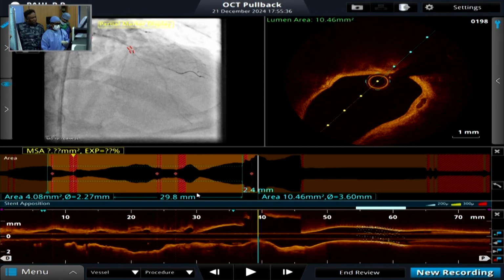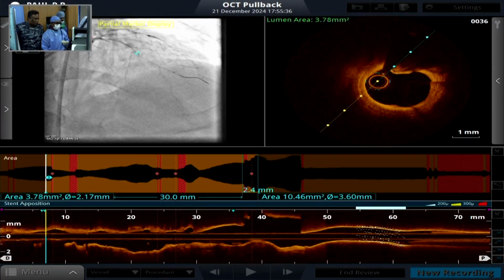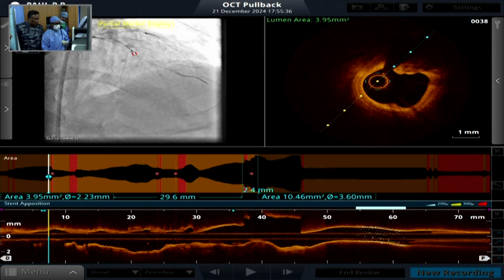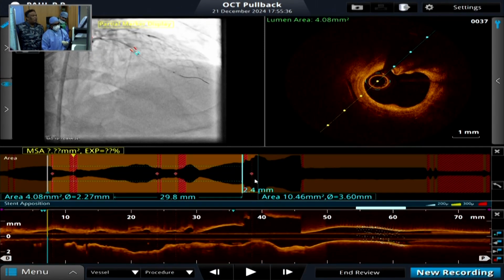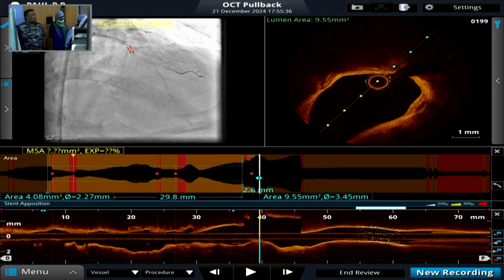29. Okay, 30. Or even Vishnu, should we offer 20? The advantage of 33 would be 1 millimeter into the left main and 1 millimeter distal. 33 would be preferable. If you haven't opened a 3, 2.75 also will be okay, because distally it's a tapering vessel. 2.75, then we'll post it with 3.5. That's what we'll do. 2.75, 33.